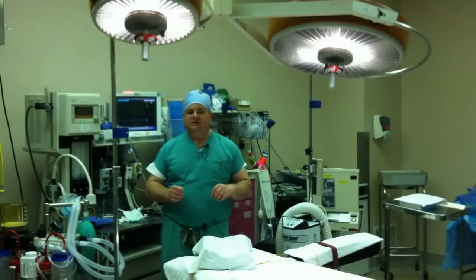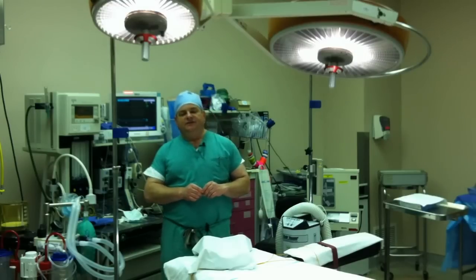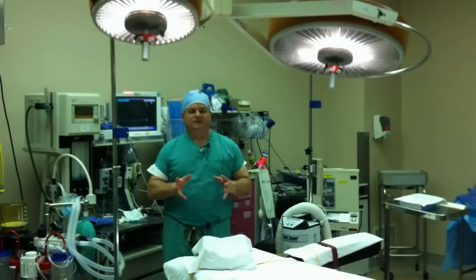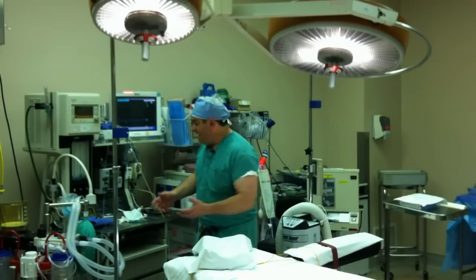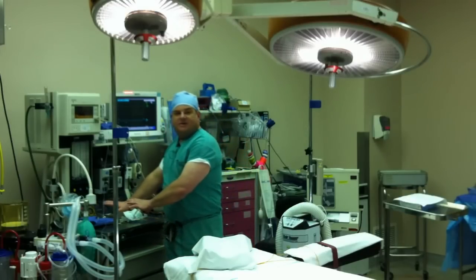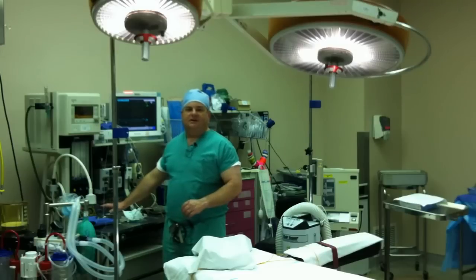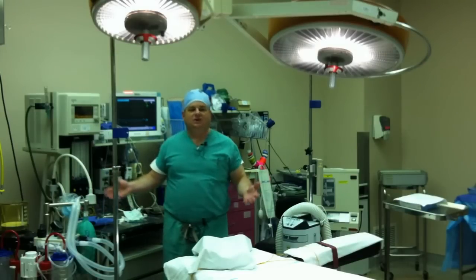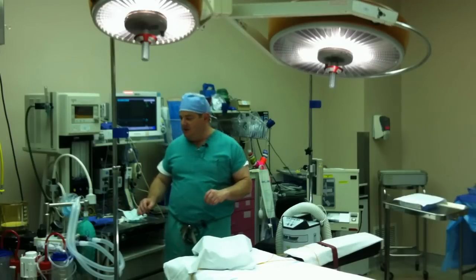General anesthesia is occasionally needed for a c-section, but generally only for really serious emergencies, so fortunately we don't have to do that very often. However, everything you see — we came into this operating room and everything is set up to put you to sleep right there at the anesthesiologist's fingertips — even though there's no reason to think we're going to need it. If an emergency happens, we're prepared to deal with it.